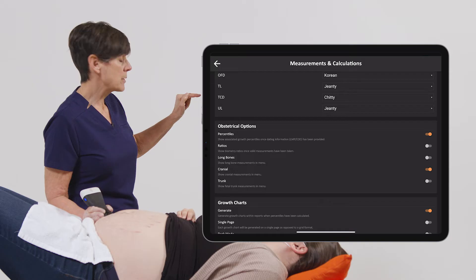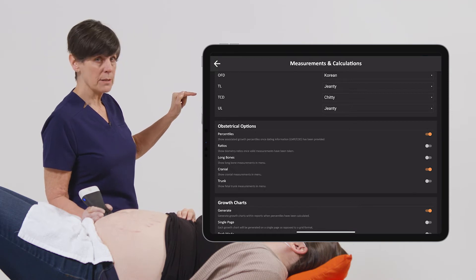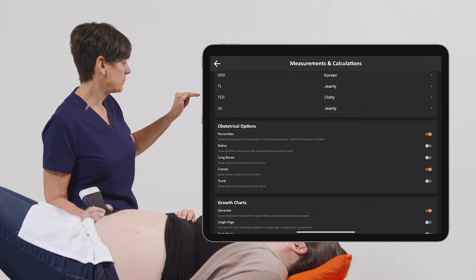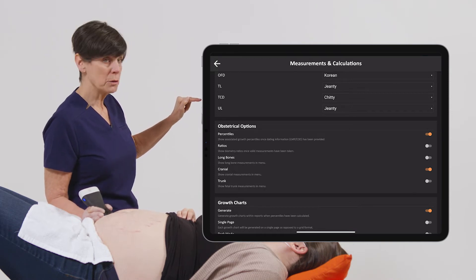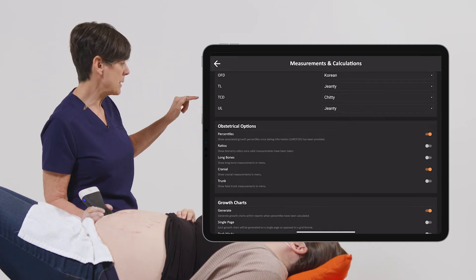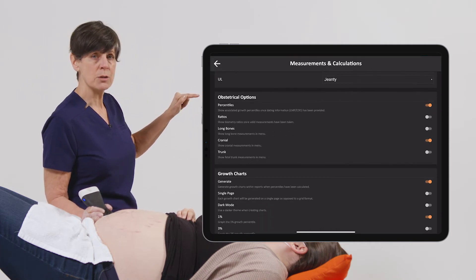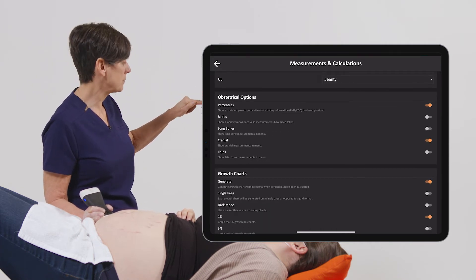We also have the ability to turn on percentiles for the reporting. We can do ratios, we can display different long bone measurements, cranial measurements, and trunk measurements.